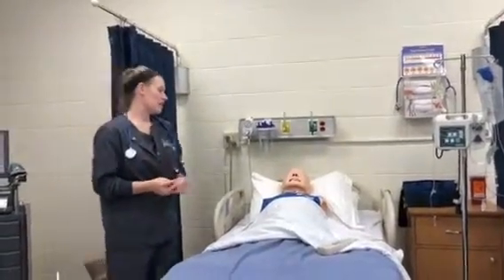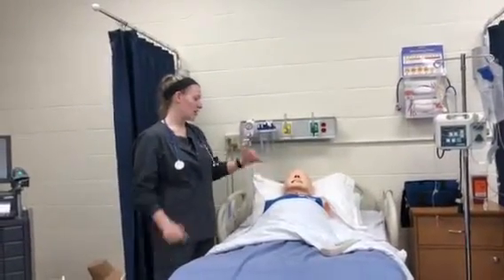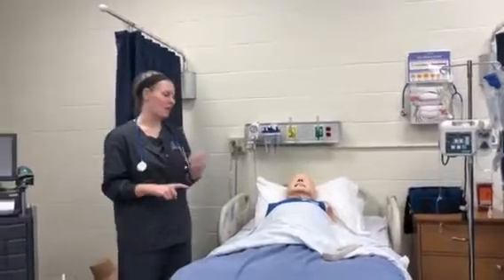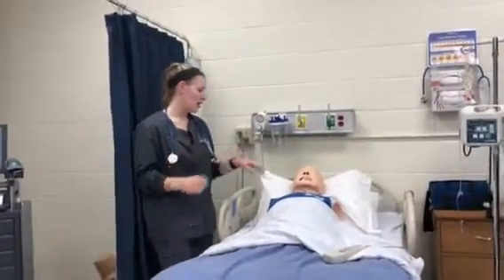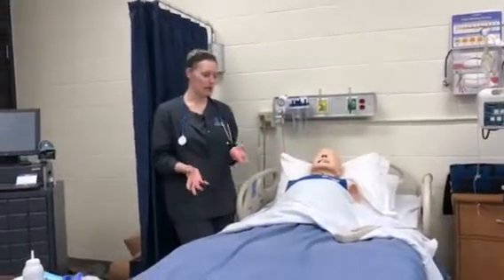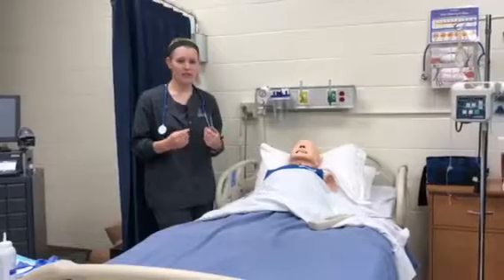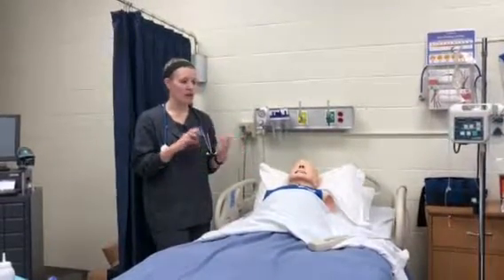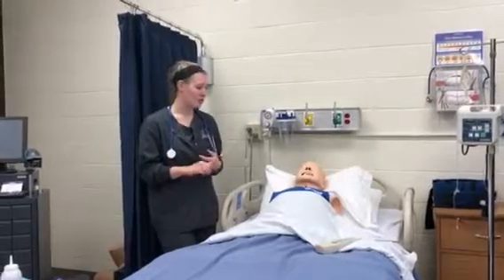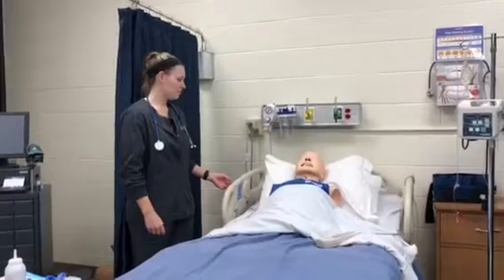So the first thing that I would do is assess my patient for any nasal surgeries, any deviated septum, any gag reflex that they have, and their ability to cooperate with me while doing this procedure. So I would identify the patient with two patient identifiers, explain the procedure of the insertion, the meds, and the removal, and I would also want to put them in a high Fowler's position.